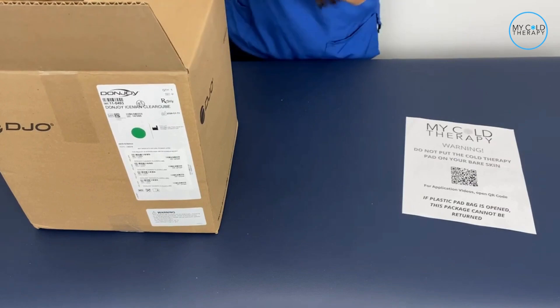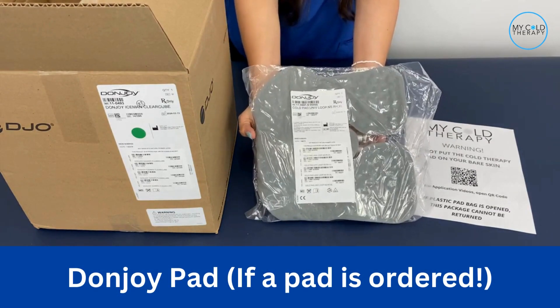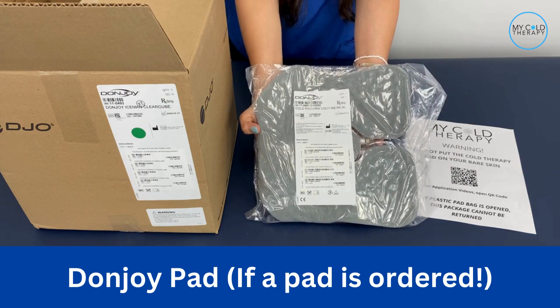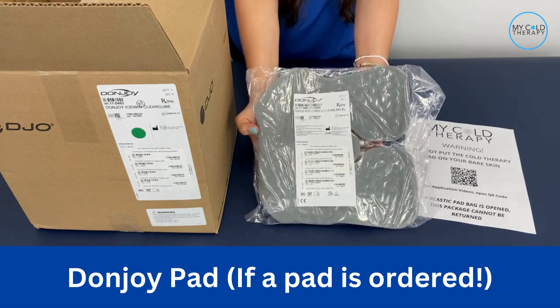Once you've gotten that, you want to make sure your pad is there. Some people don't need a pad — some people just need the system — but for those of you that selected a pad, your pad should be inside the box and it will be for whatever body part you're treating.